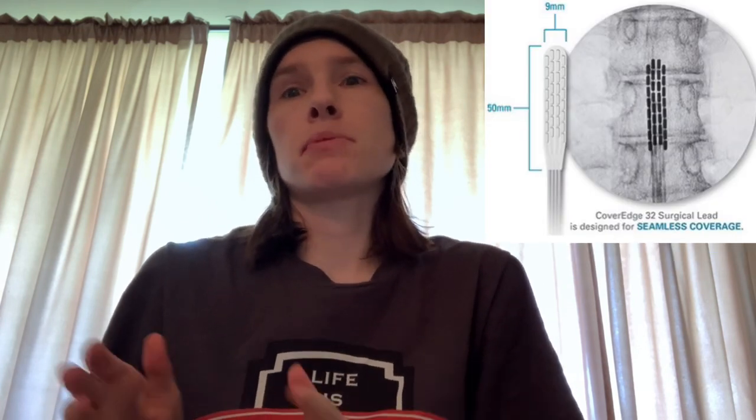Hey guys, so today I decided I'd take a little bit of a break from recovery videos and do a bit of a comparison. Because now I have a Boston Scientific, I have the Wave Rider with the 32 contact paddle — that is my spinal cord stimulator. And then I have the DRG put out by Abbott, on my S1 dorsal root ganglion. I wanted to sort of go through the parts that you're given after you have each implanted, because they are similar, but they're very different.